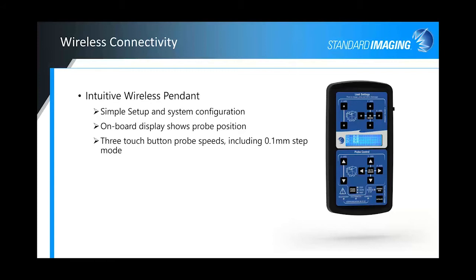Nice thing too, it also has an initialize button on the pendant. So when you turn the Phantom on, it'll automatically initialize, but you can initialize it from the pendant as well.